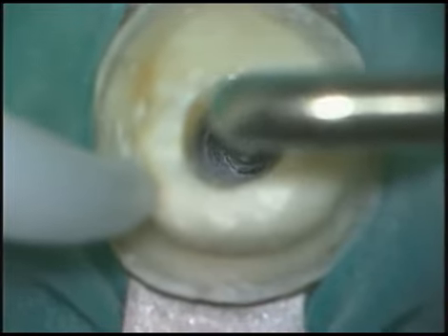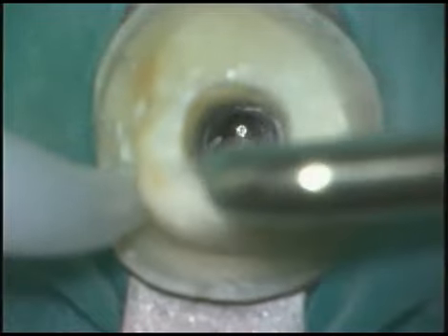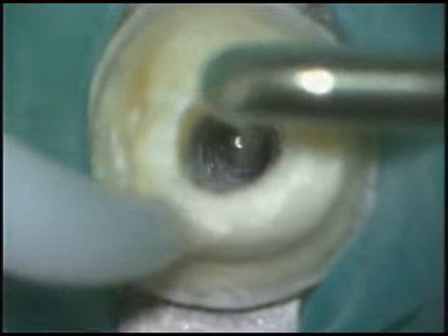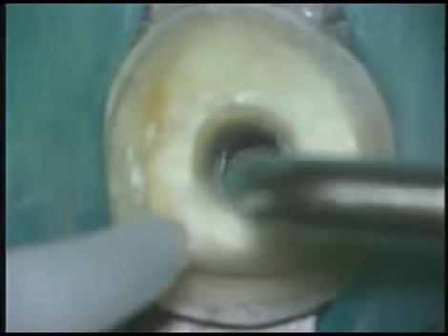As you can see, we can progress to smaller profile titanium instruments, which will put us deeper in the canal safely and preserve maximum remaining dentin. The idea is to get this obstruction to move and to begin to get it to vibrate and to wiggle. Gently tap down in an apical manner, and that'll tend to kick the broken obstruction out of the canal. Floating and suspended debris can then be suctioned out of the tooth.